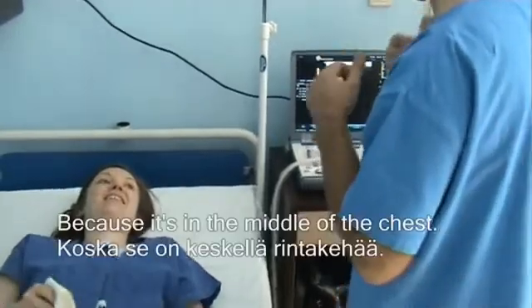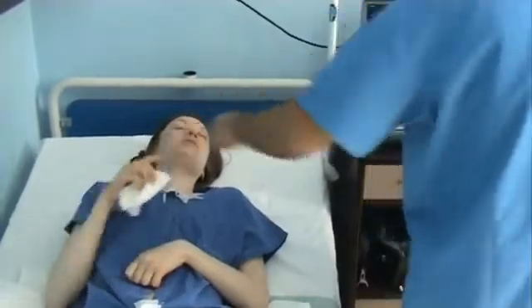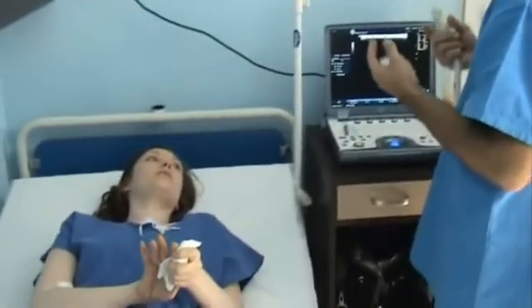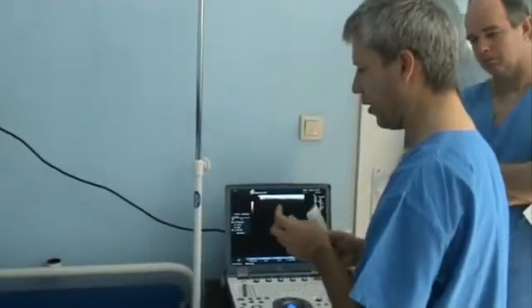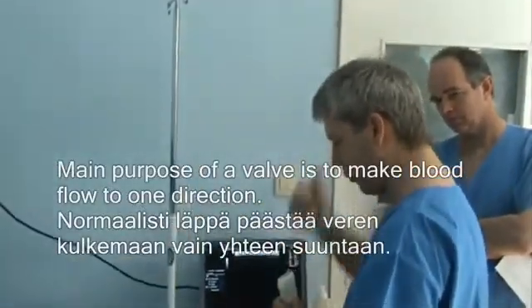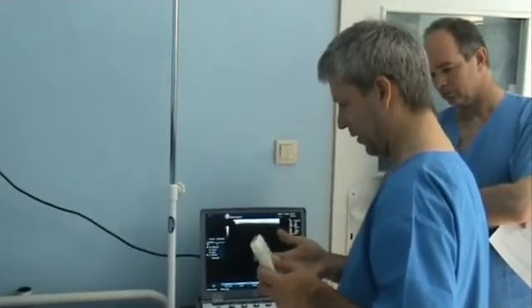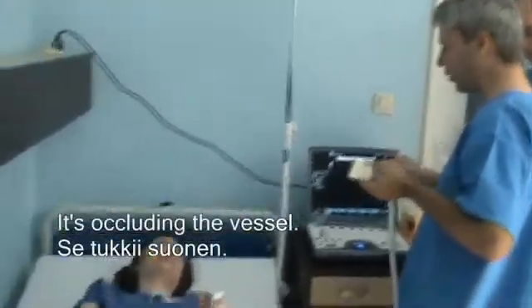It's in the middle of the chest. The problem is here. What did you say about the valve? In a normal healthy person, there's a valve in this area. The main purpose of this valve is to make the blood flow from the brain towards the heart, in one direction. This is the normal situation, but your valve is doing something opposite — it's not making the blood flow normally, but it's occluding the vessel.